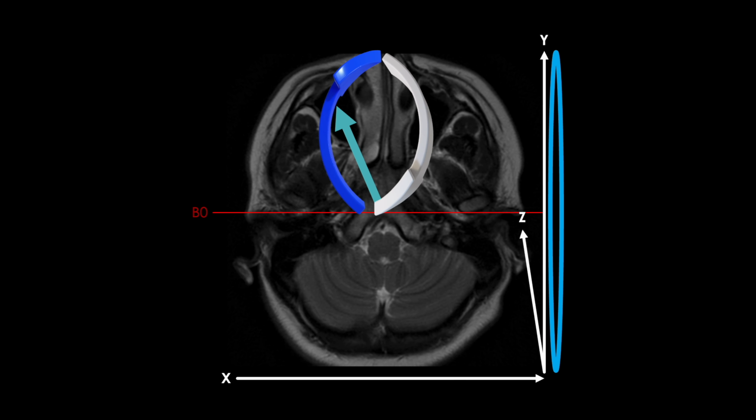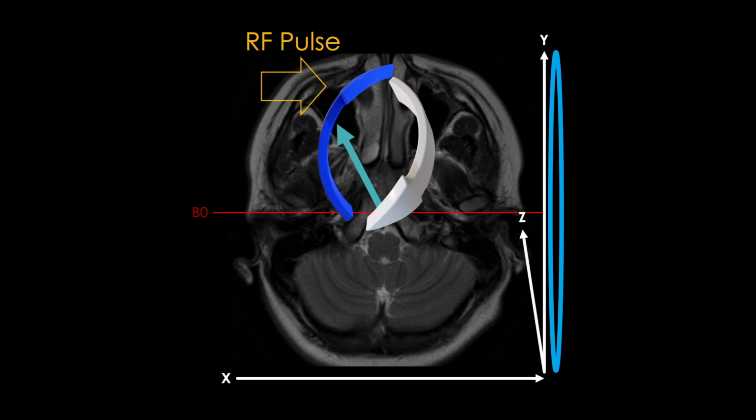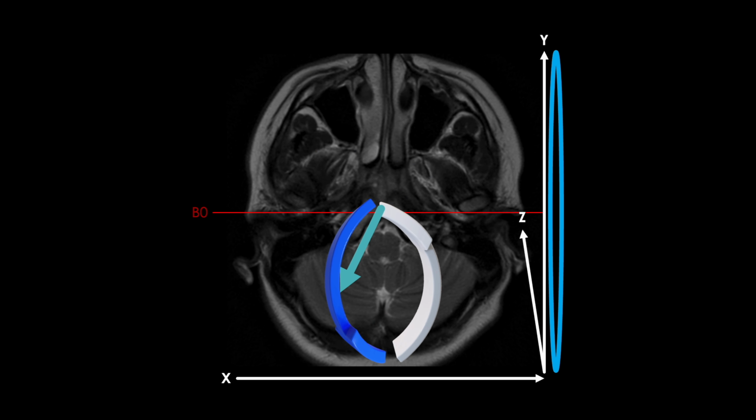This one before the large flip from the secondary RF pulse, and this one after. Comparing the two, notice that by flipping this into the other half of the XY plane, we do in fact change the rotation relative to our receiver coil. Do you remember the right-hand rule in physics?